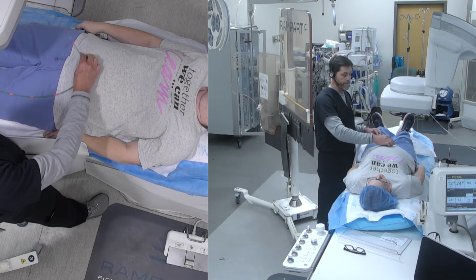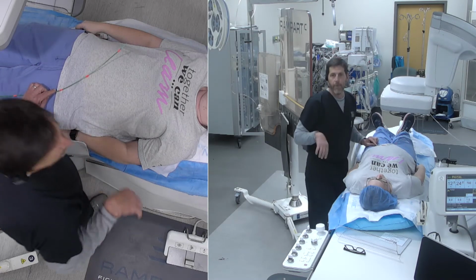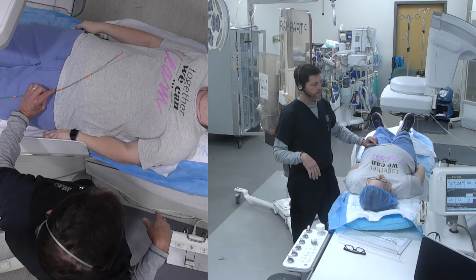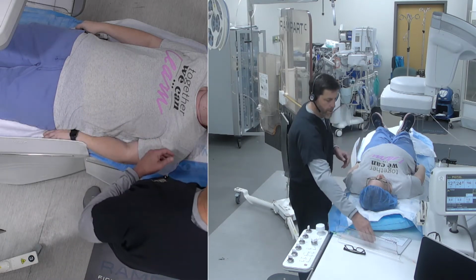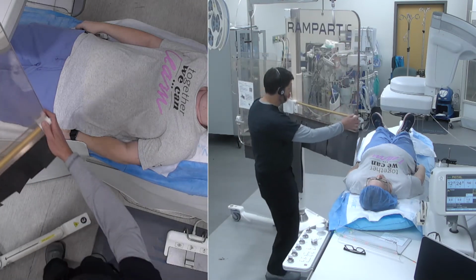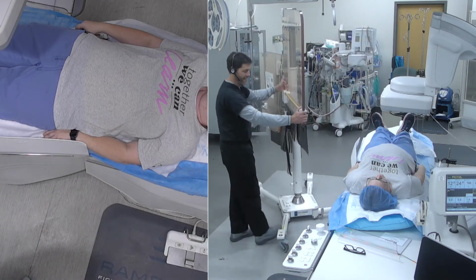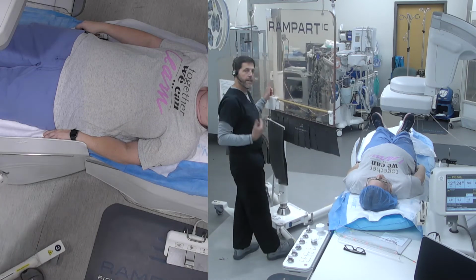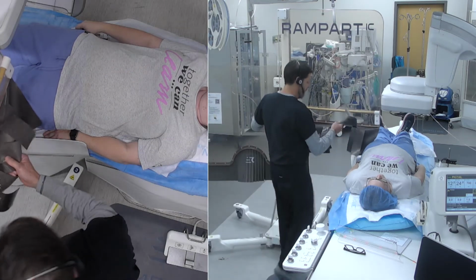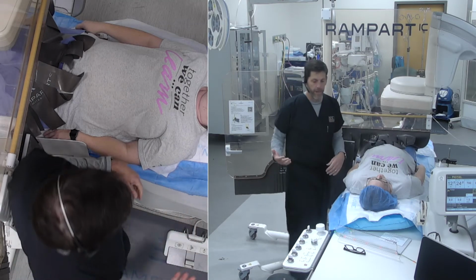Once it gets up and over and I have that in position, then I'll actually break scrub, take my lead off, put my sterile gown back on, and move the Rampart back in. So once you take your lead off and get scrubbed back in, you basically just slide the Rampart back in right over the leg. Okay, and you're ready to go for the long case.